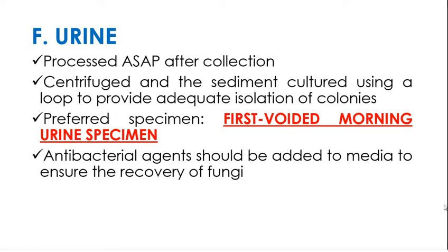Ano yung kinakatch natin? Midstream catch. When you're talking of urine, the method of collection is micturition or urination. Pero pag urine ang sample, you always get the midstream catch. Why? You eliminate pa rin yung bacteria sa una at sa huli. Nakalagay dyan na antibacterial agent should be added to media to ensure the recovery of fungi. Otherwise, pag wala siyang antibacterial, natalo si fungi ni bacteria.